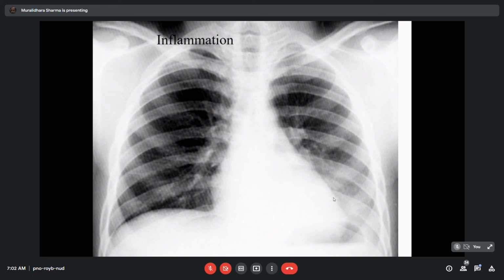You got the point. So whenever the X-ray has to be studied and the report has to be written, you will have to start from the beginning, starting with the quality of the X-ray and all those basic position issues. Then you have to confirm that you have examined every segment of the X-ray properly. So that's the correct method of reporting X-rays. You are not supposed to jump to the diagnosis. Of course, in our classes, we may bypass those basic steps in future because we'll have to save time.